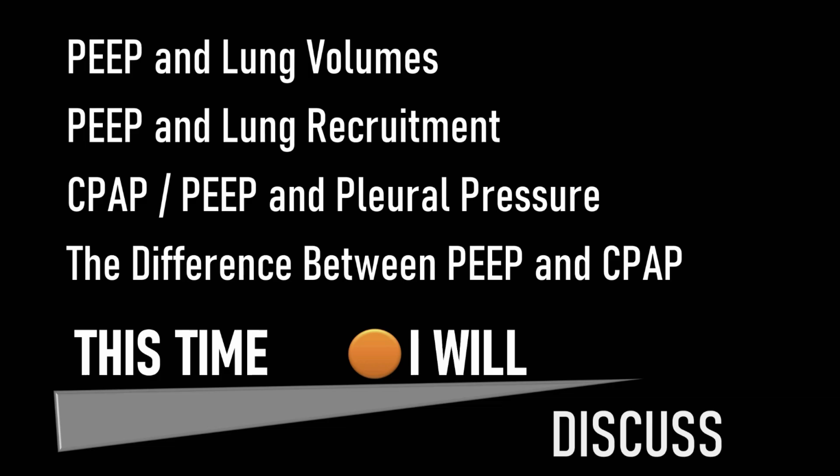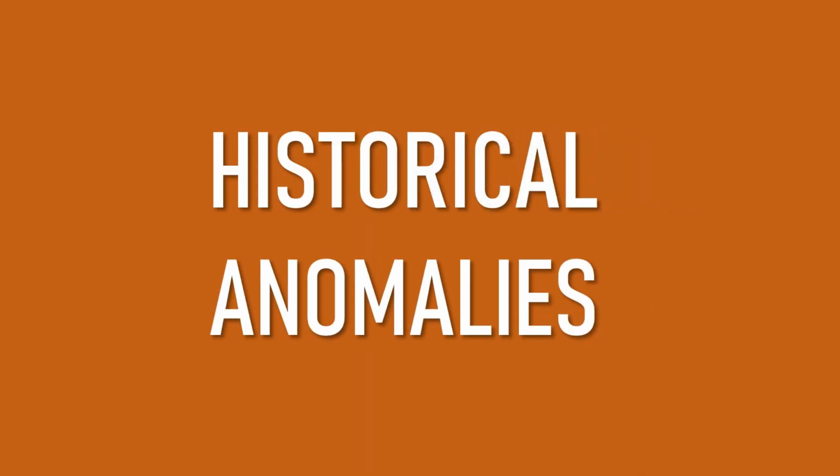Before I get started though, I just thought I might mention historical anomalies in the nomenclature. It's important to understand that the term PEEP and the concept of PEEP arose in the 1960s, and it started being used in postoperative patients who'd had major surgery, had a lot of atelectasis, and physicians found that applying PEEP to these patients prevented atelectasis and improved their overall gas exchange.